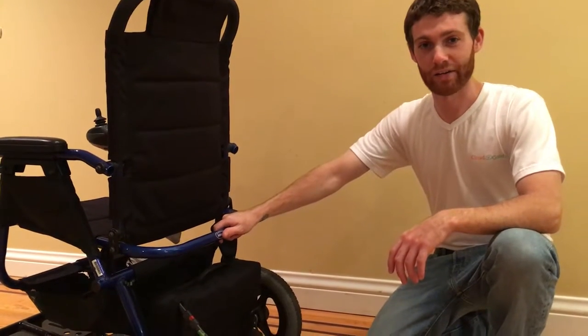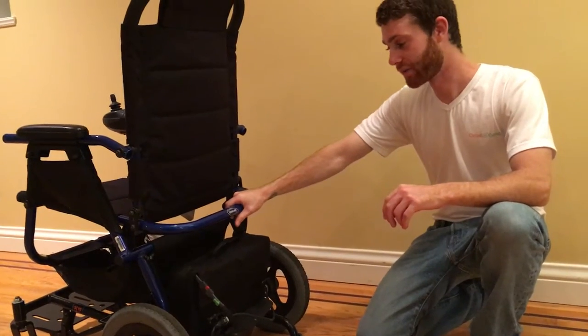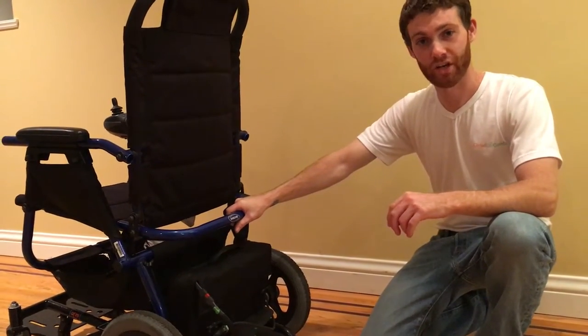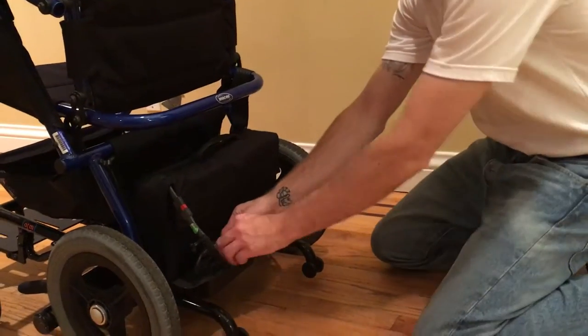Hi, this is Eric with Cloud of Goods, and this is how you disassemble and reassemble our Invacare ATM wheelchair. The first thing you would need to do is take out the power cord.